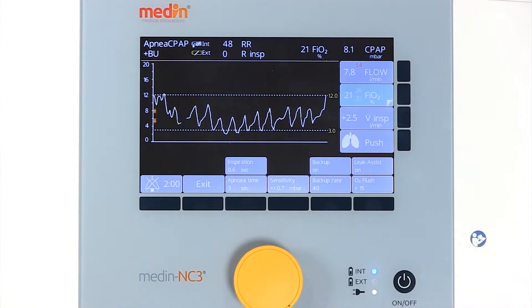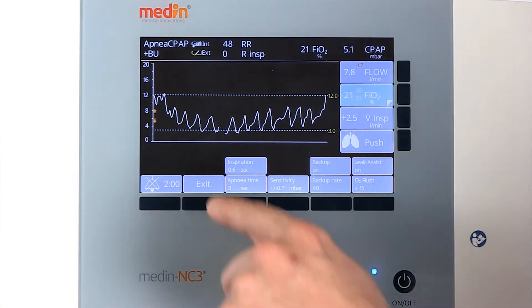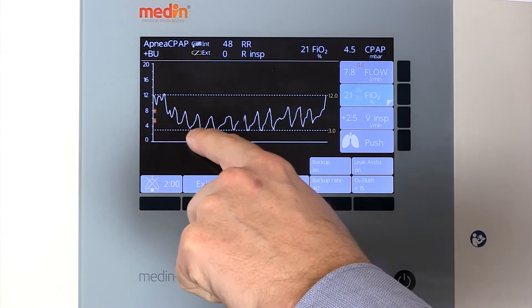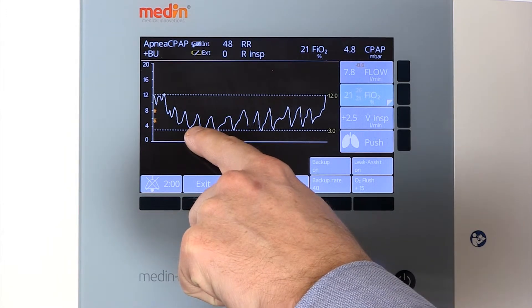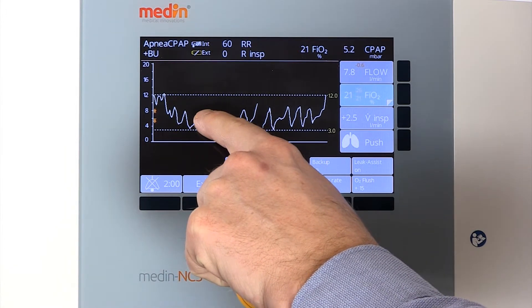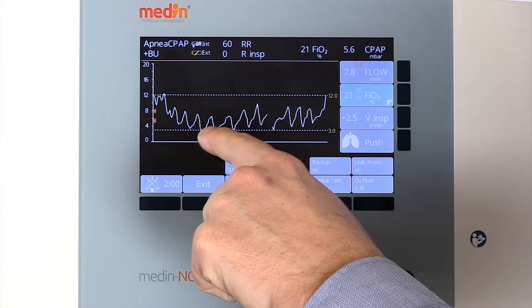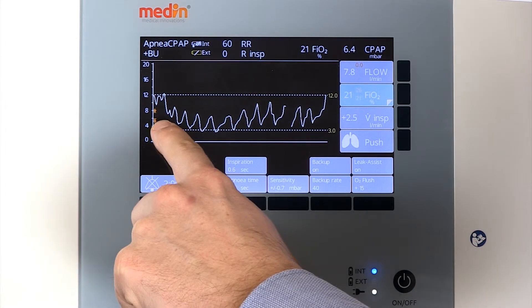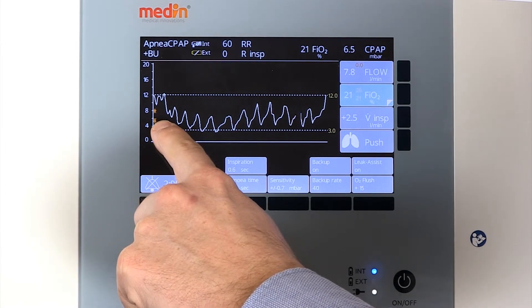The baby's inspiration and expiration generate the upper and lower pressure levels. The sensitivity of the pressure trigger can be adjusted manually, enabling you to react properly to the baby's spontaneous breathing activity.